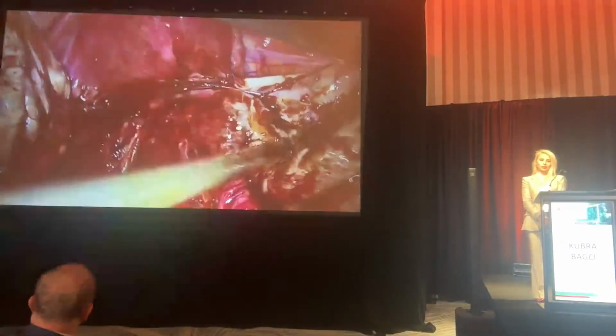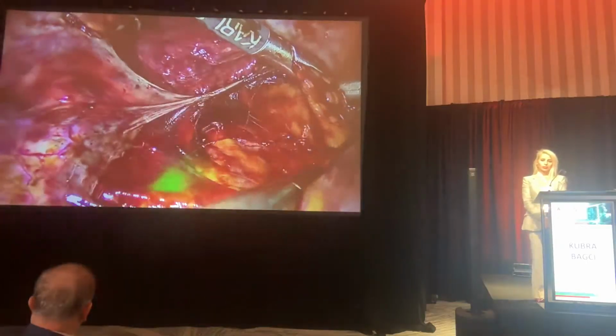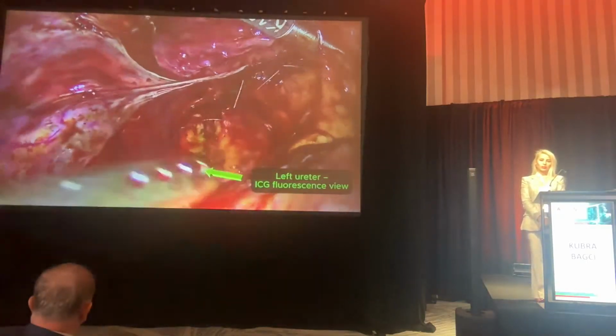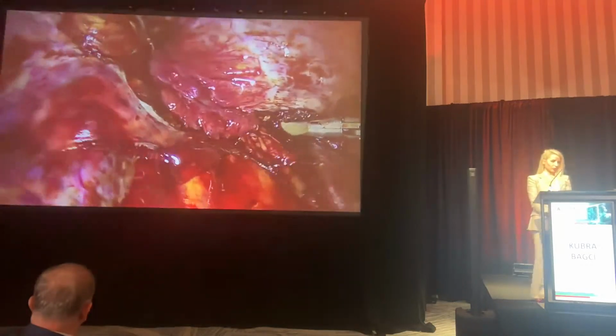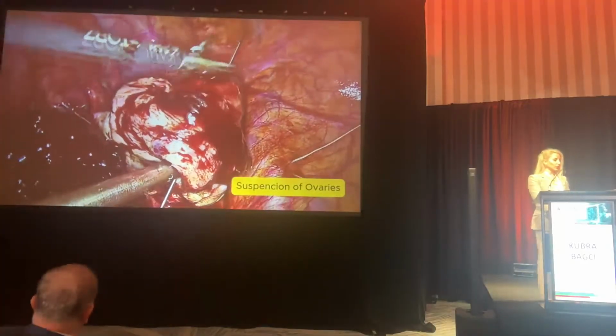After partial mobilization of both ovaries, dissection of the left pelvic sidewall was continued. The left ureter was visualized under ICG fluorescence. To improve visualization of the dissection planes, both ovaries were suspended.